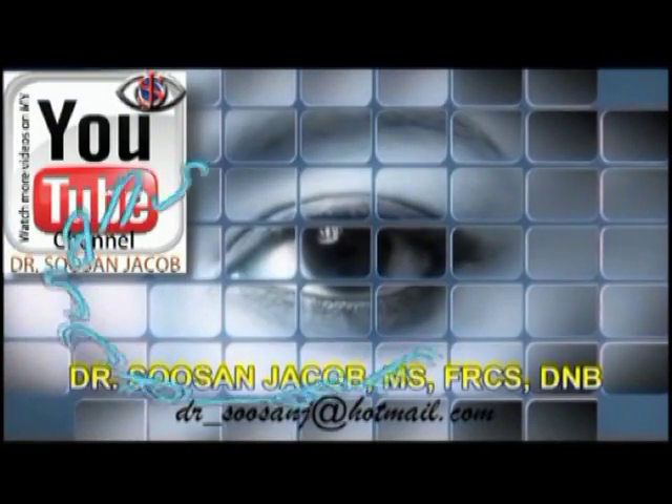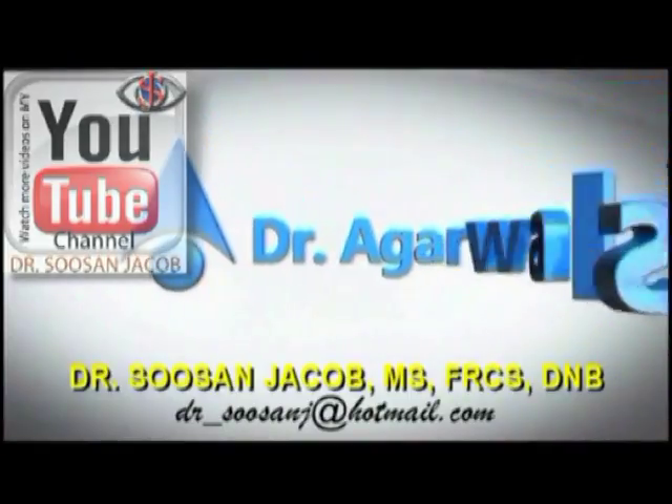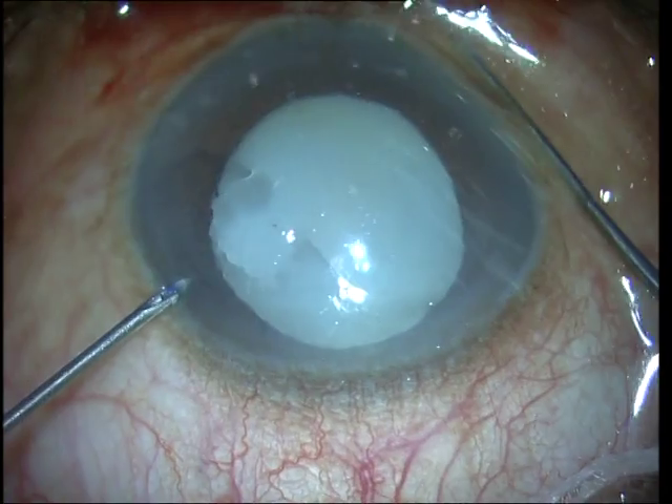Hi everyone, I'm Susan Jacob and in this video I'm going to show you some cases of white cataract phacoemulsification. The first case is going to show you the problems that can happen while doing rhexis with a leaking Morgagnian cataract.